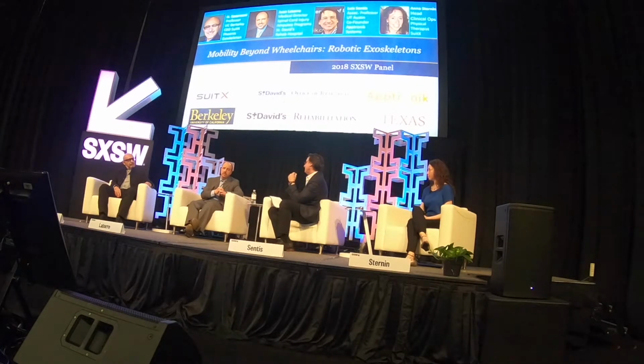I think the other issue we have with these devices is that they require an extensive training period. So you need your cognitive abilities to be able to use it. Some patients with strokes or traumatic brain injuries may not be cognitively able to learn to use these devices. So I think the technology needs to improve, and it needs to be tailored to those conditions. But even if it's for, say, an hour, a couple of times a week, that can prove to be beneficial to prevent some of the serious complications I mentioned. I don't think we're quite there yet to replace the wheelchair, but I think this device needs to be more available for many different conditions.